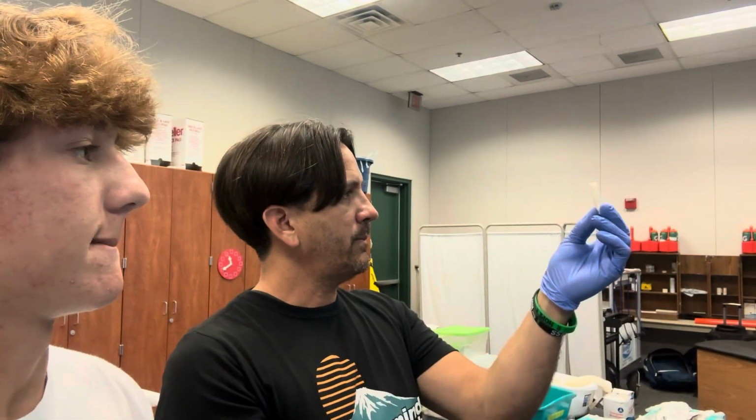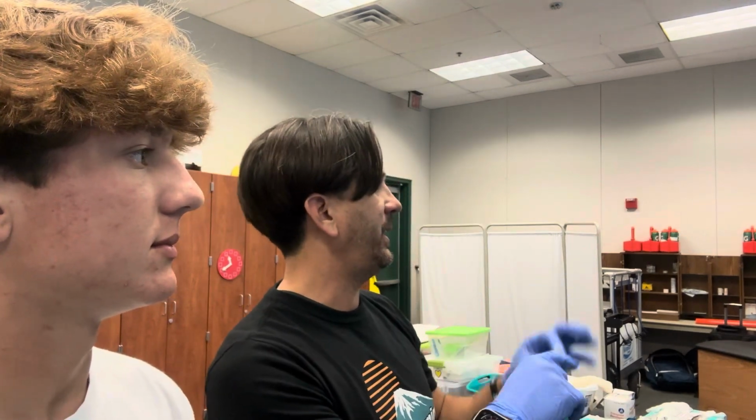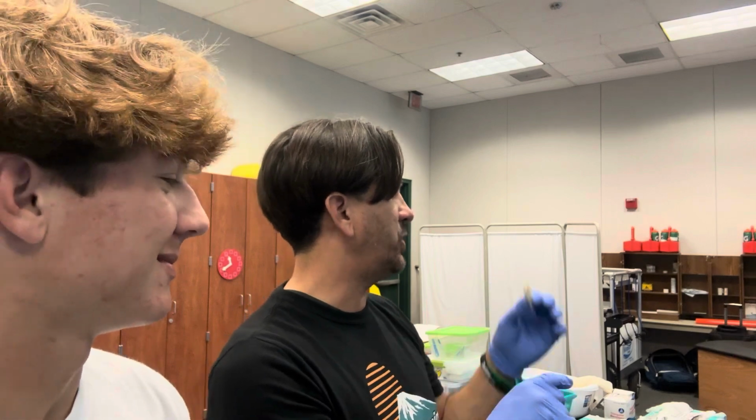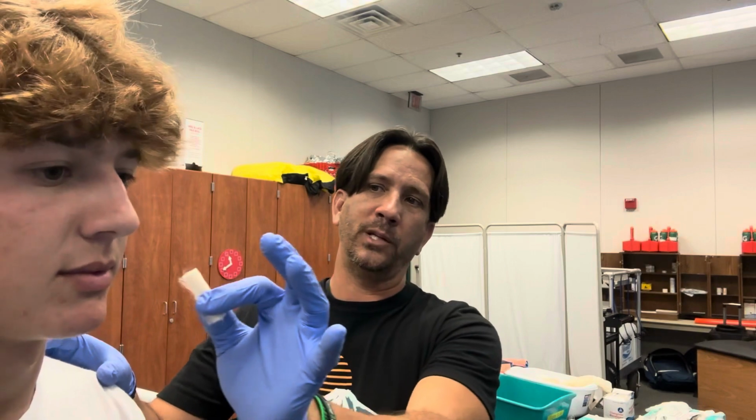First thing I'm going to do is take this BleedCease out. Usually they're pretty long, and so for athletes at the high school level, these are a good size to pack in the nostril. Little kids, you typically have to cut them in half in order to allow an entire one to fit. Otherwise, the majority of it will be sticking out of their nostril and just fall out. This basically will go into the nostril first. Then you'll take your gauze pad out.